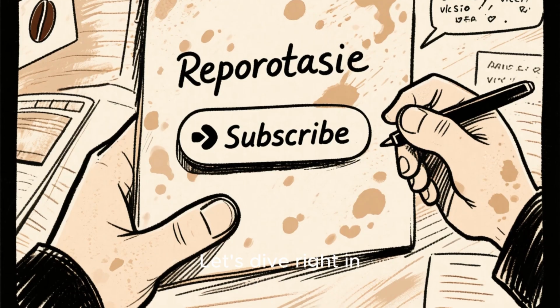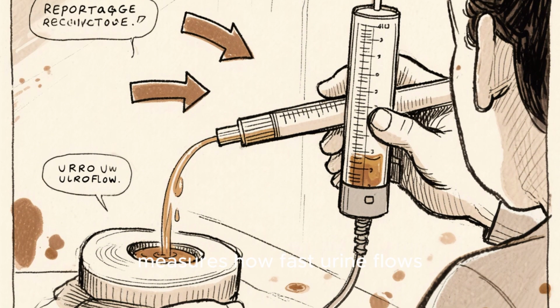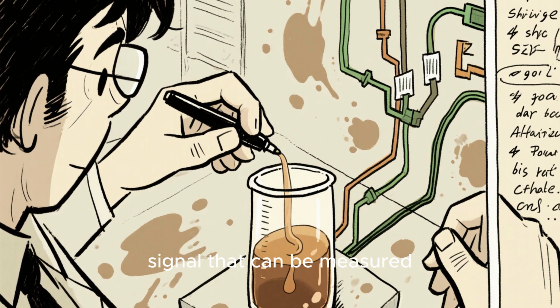Let's dive right in. So first off, what is a uroflowmeter? Well, it's a device that measures how fast urine flows from the body when you pee. It does this by turning the weight or volume of urine into an electrical signal that can be measured.